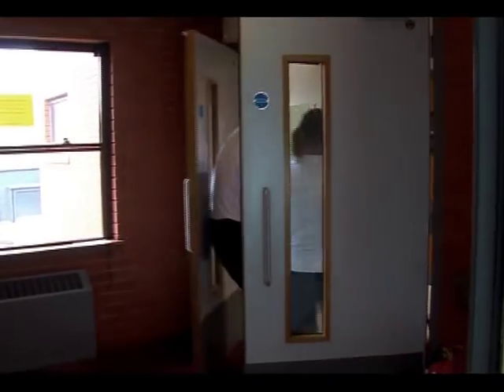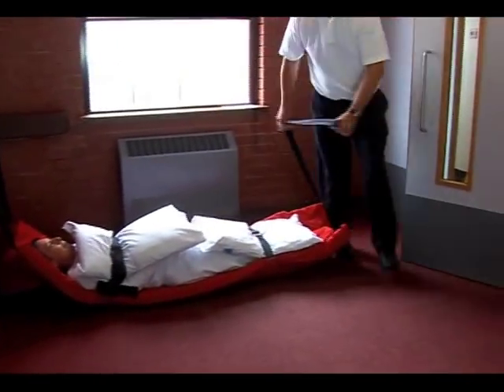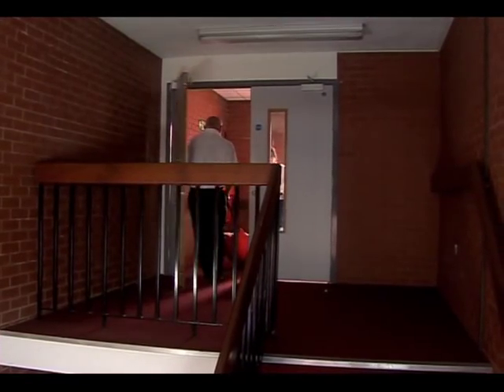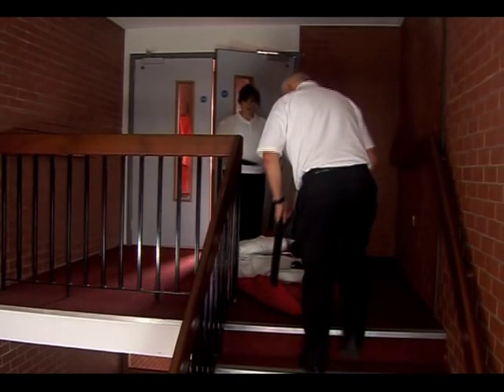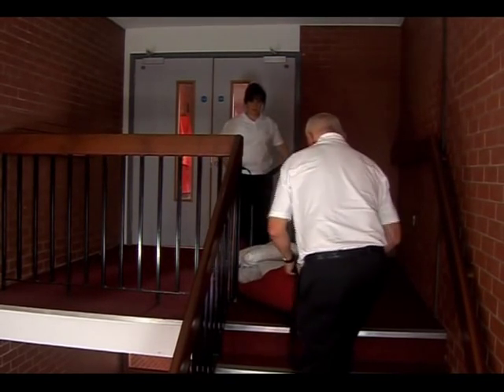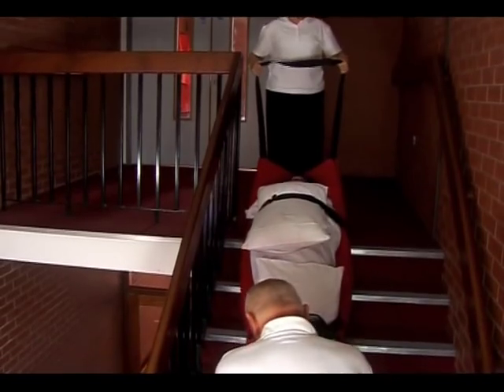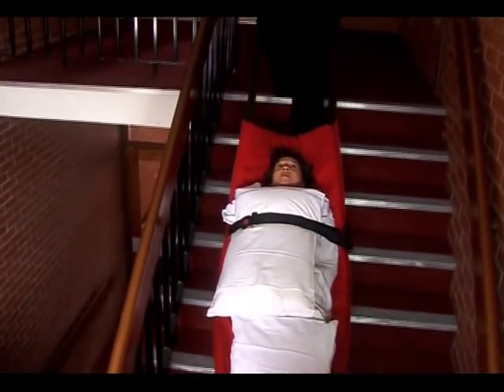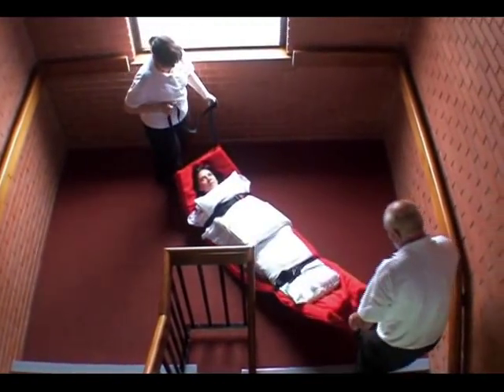Before you start to remove the ski pad from the bed, ensure that the bed is at its lowest height setting. When you start to move onto the staircase, it is very important that the person in control of the bottom end of the ski pad keeps the pulling handle short until the upper part of the body has come over the top step. By doing this on each separate run of stairs, you are protecting the hip and pelvic areas from excessive bending during the descent. The person at the top of the ski pad can assist by keeping the pulling handle long and by slightly raising the handle as the body comes over the top step. It is important to steer a wide course around any corners of the staircase to ensure that you do not encounter any problems with the central pillar of the staircase when turning.